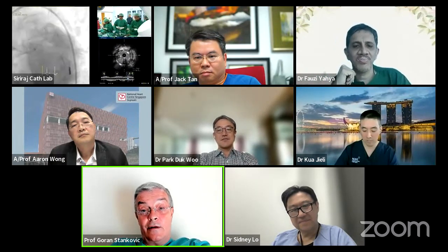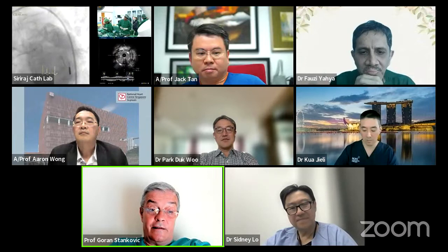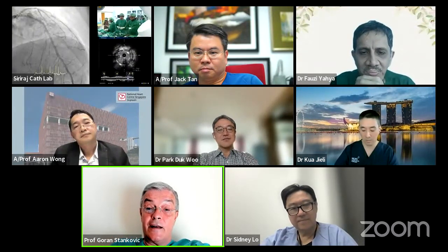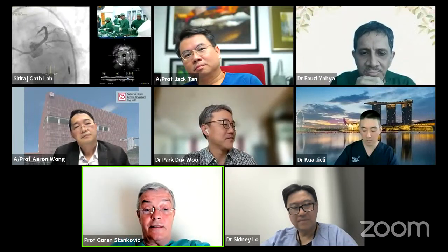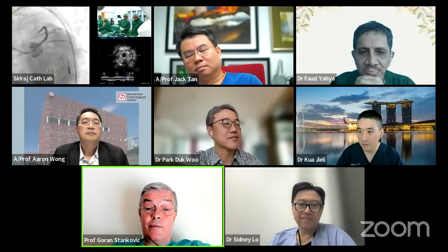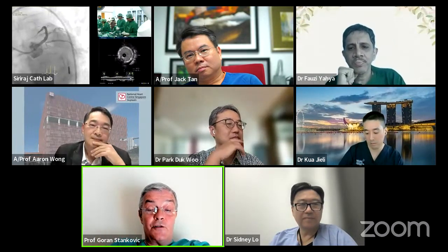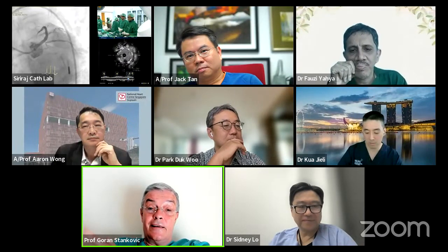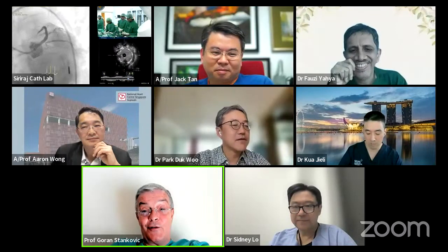So we have to work in the real world, and for the majority of PCI, we have to admit that nowadays imaging is not really part of everyday life in a real world scenario. I think there is a benefit. I enjoyed very much the initial discussion from the cath lab today, discussing the plaque composition distribution, planning the strategy. I think it's of course extremely valuable. If you use imaging, you get extra information. But you have to really react according to imaging if you want to achieve the benefit. In the real world, we work more in line with Professor Wong's lecture, that we have to estimate based on angio for the majority of cases. Thank you. Thanks. Again, very pragmatic approach.